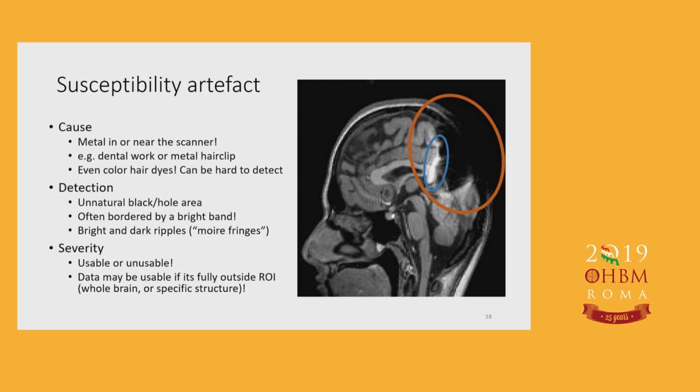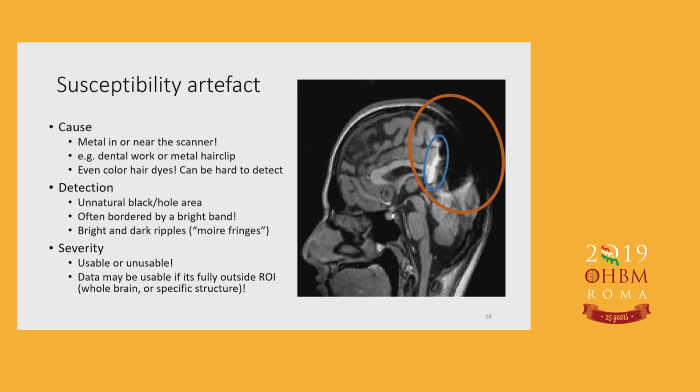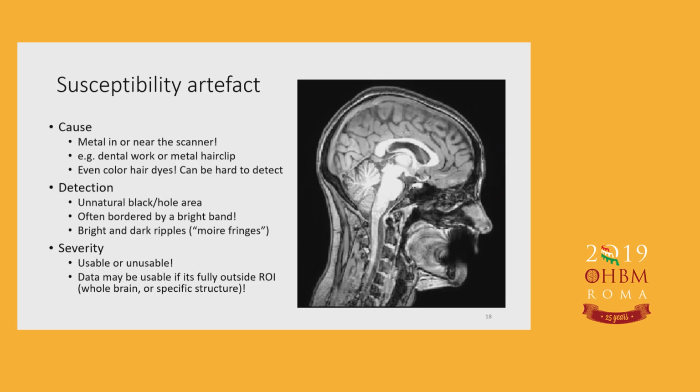If it is fully outside the ROI, I think the data might sometimes be usable, but it really depends on how it's acquired, so you want to keep that in mind. In this case, this is very bad, I don't think it's usable. This might be, depending on how the full volume is.